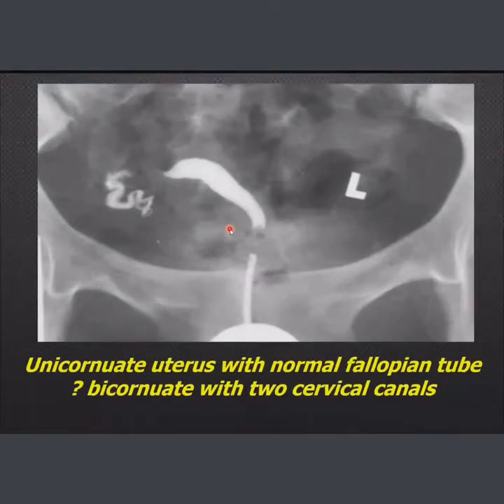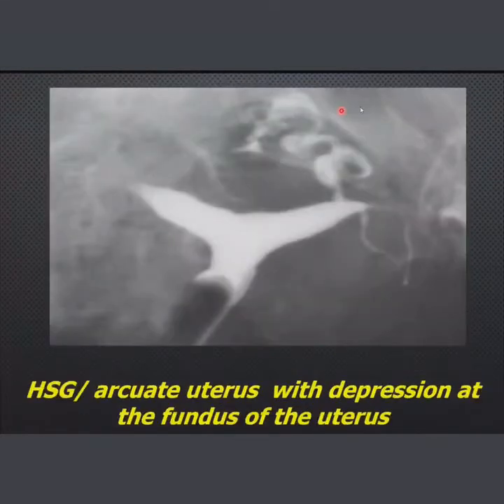حاليا هسه احنا بما أنه نشوف الأنوماليز بالـ MRI حاليا المين رول is for assessment of tubal patency يعني patients with infertility حتى after exclusion of hormonal and ovarian causes فراح يسوون hysterosalpingography to assess for tubal patency. راح يشوف الـ tube is it obstructed or is it patent. شلون أعرف أنه obstructed or patent؟ شوف spillage.